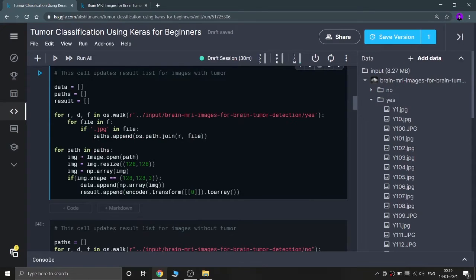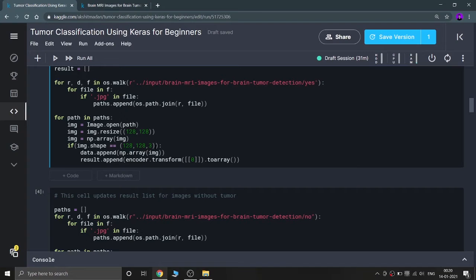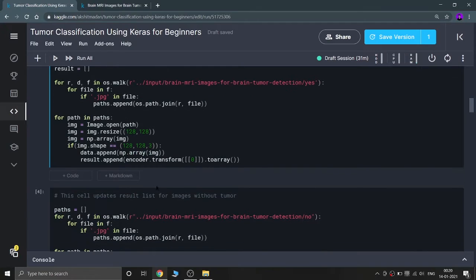Then I iterate through each path, read the image using PIL, and resize it to 128x128, because I can't feed different-sized images to my model — I need a standardized size. I convert the image to numpy form using np.array, and if the shape is (128, 128, 3), I append it to the data list. Then I one-hot encode the answer as 0 (tumor) and append it to the result list.